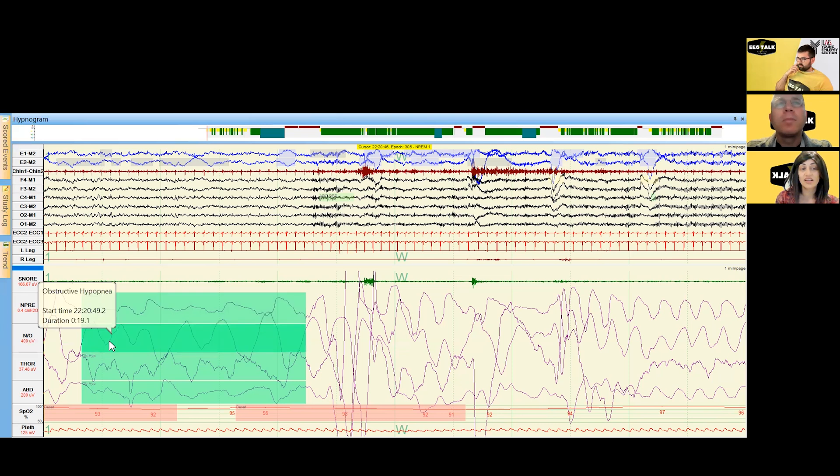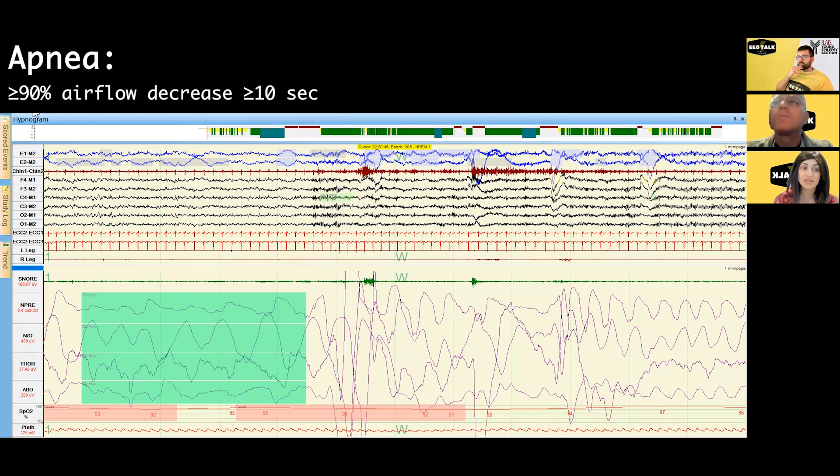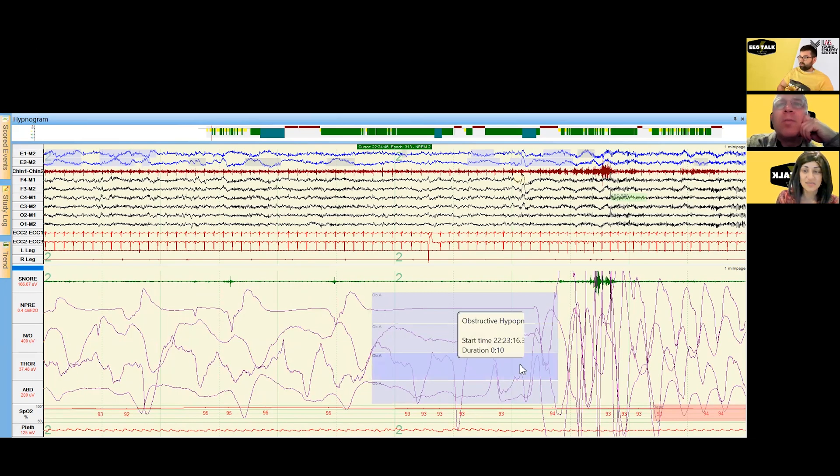For hypopneas — decrements in airflow — we score those off the nasal pressure transducer. We score apneas off the thermistor, so we're really looking at both simultaneously. The effort belts help us classify obstructive versus central, or mixed, which has features of both. For hypopneas we need the aftergoing consequence of either a cortical arousal or oxygen desaturation, but for apneas — where there's at least a 90% decrement in flow through the thermistor — we don't need that demonstration.